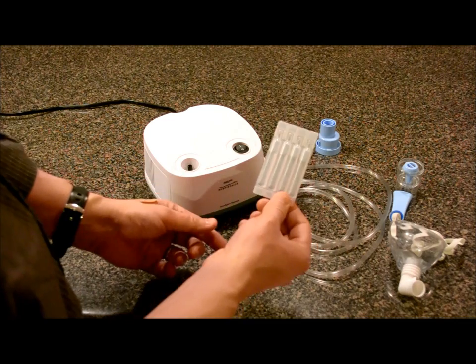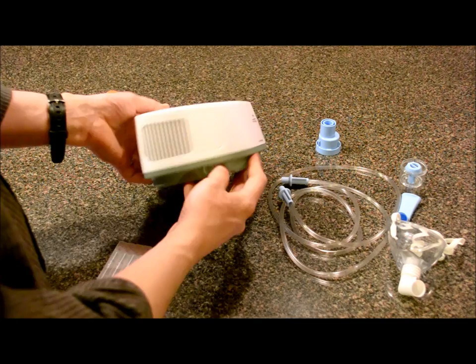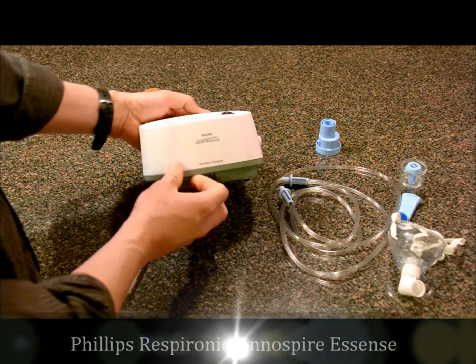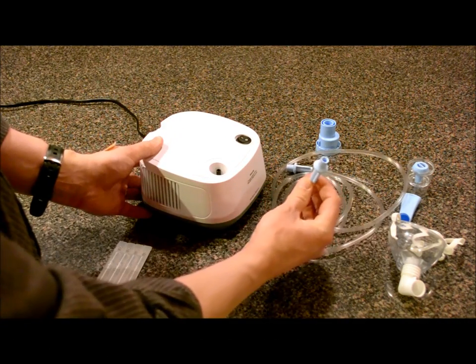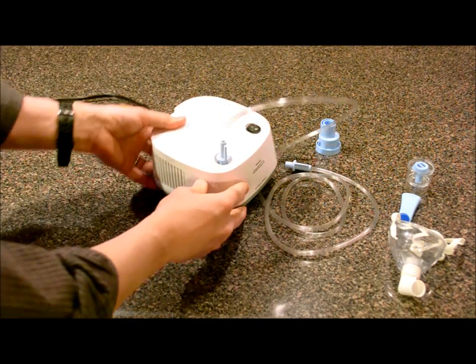So I'm going to show you how to load liquid medicine into a nebulizer. First, you're going to have some sort of an air pump that looks like this — it has a little hole for the air. This one is a Philips Respironics InnoSpire Essence. The first thing you want to do is take one of the hoses and put it on the air exhaust there — that's what's going to blow the air into the medicine.